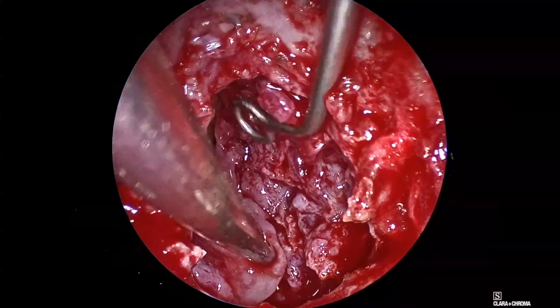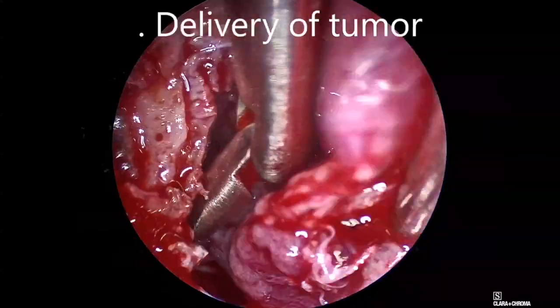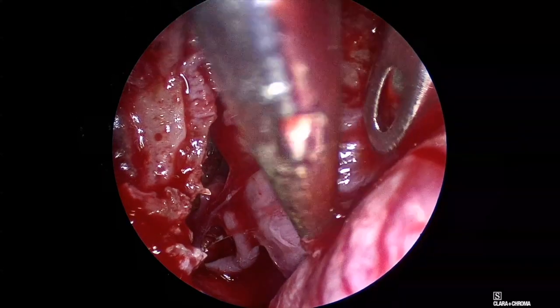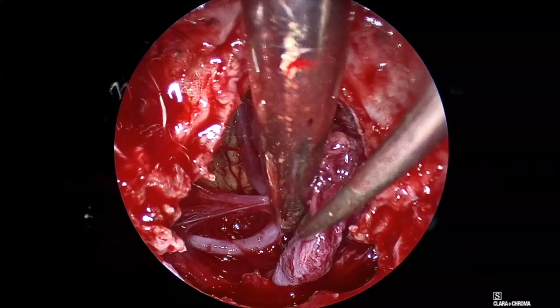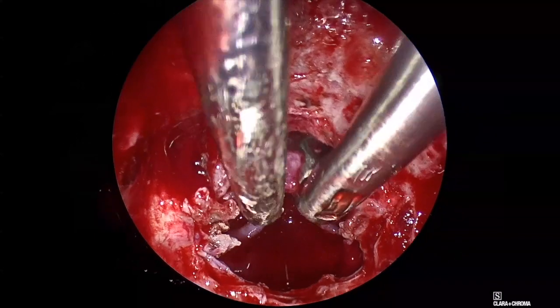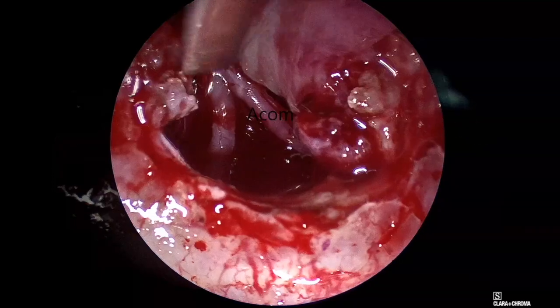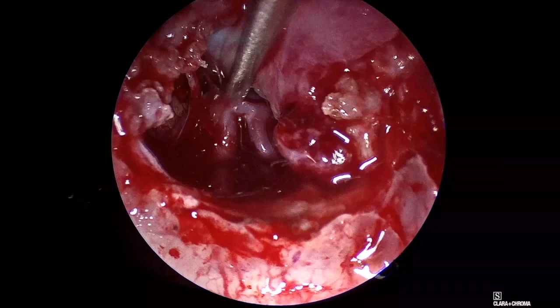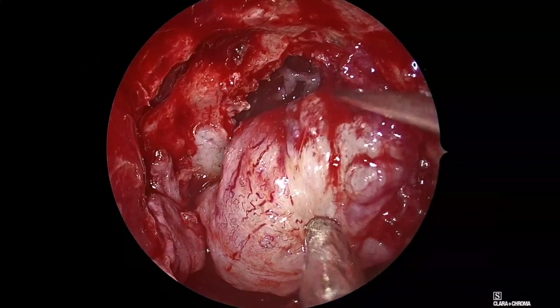The delivery of the tumor was carried out incrementally so that further deeper visualization could confirm any residual attachment. The ACOM complex was the last to come into view as it was directly posterior to the tumor and intimately associated with the capsule. Protecting the ACOM complex with a long curved flat dissector, the capsule was gently peeled away. Once the capsule was confirmed to be free all around, it was gently mobilized out.